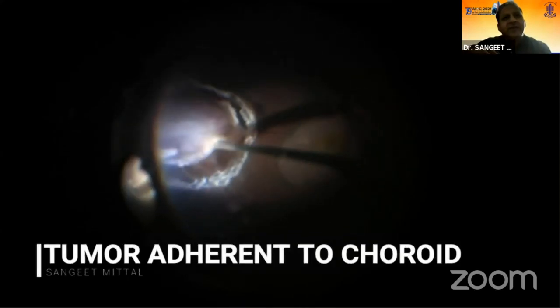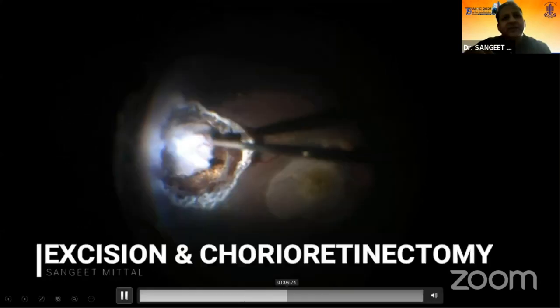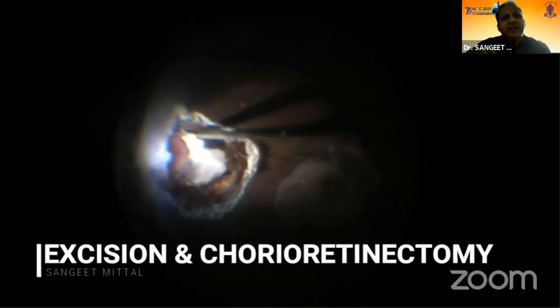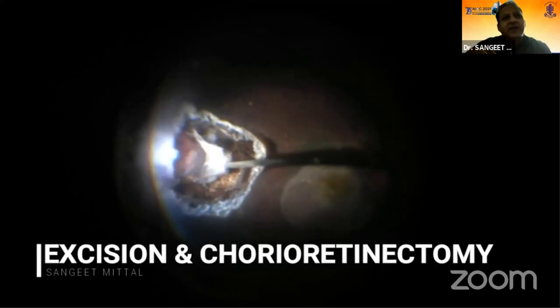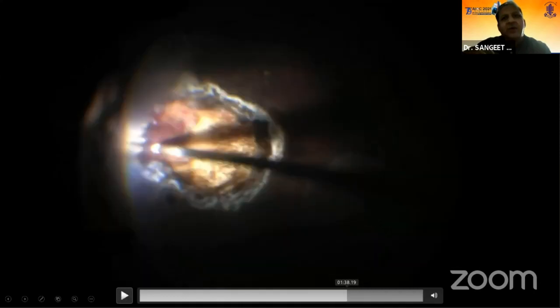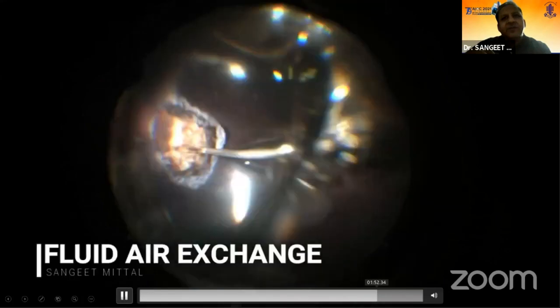You can easily see now we started doing excision of the angioma. You see, it is adherent to the choroid. So we planned a chorioretinectomy in this patient. We were able to excise the whole of the tumor along with the retina and the choroid. And we did diathermy at the base of this tumor. And then we put a long-acting gas as a tamponade in this patient.